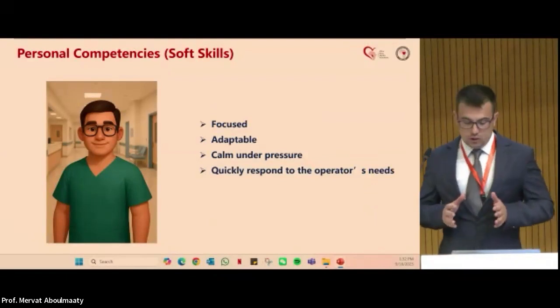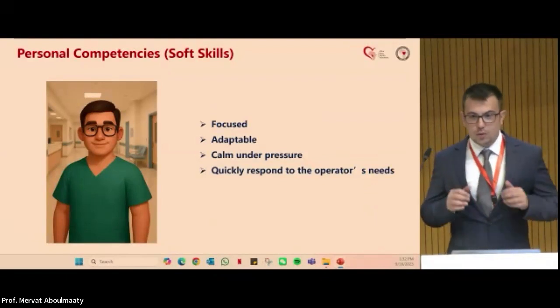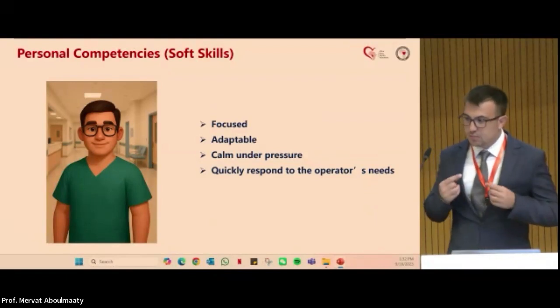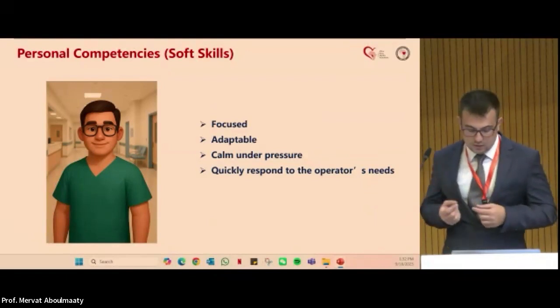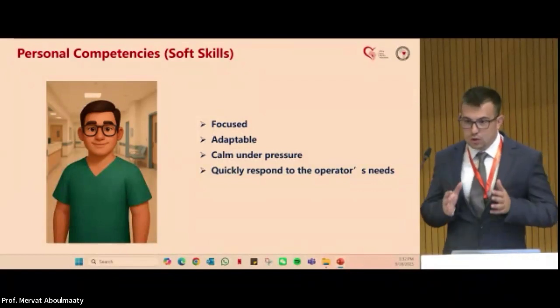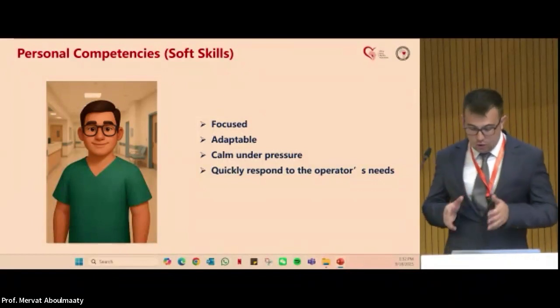First of all, the technician needs to be focused. When we are performing a case, we are searching for some small signal. It can be His, which is very important. So we need to focus on the screen and we need to collect the points from the heart correctly.